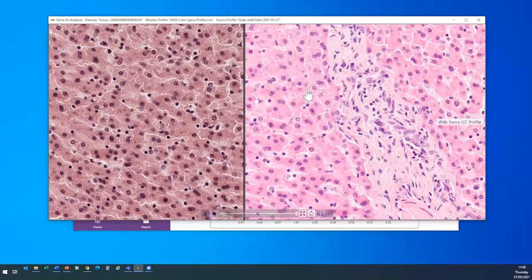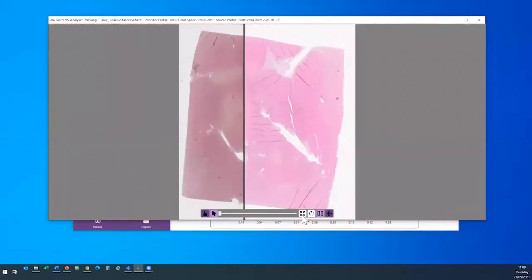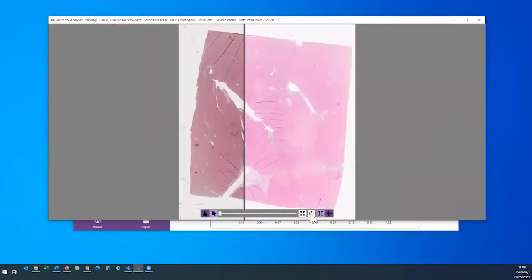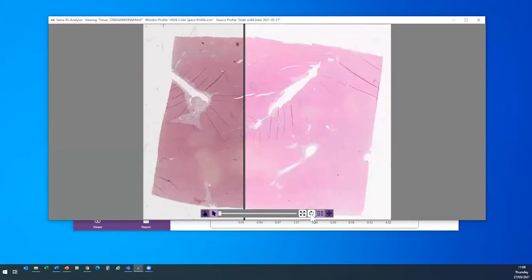Multiple instances of this viewer can be opened to enable analysis of different tissues from the same scanner, or to use the History tab to enable analysis of the same piece of tissue across different scanners. And so therefore, there is also, alongside a resize function, a rotate function to allow for ergonomic alignment of different pieces of tissue from different scanners.